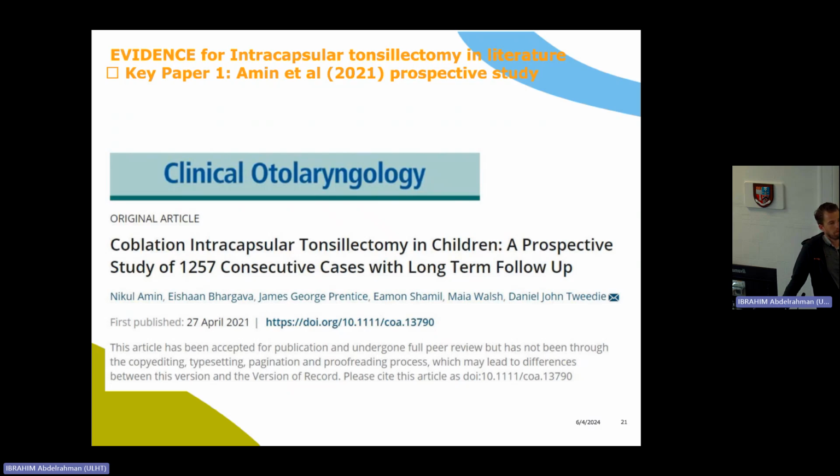But millions of these have been done now, and there's nothing that's ever come back. It doesn't create any other material or reaction that I'm aware of that can cause harm in any way. Like I said, the only thing that is created is sometimes the gas plasma, the kind of smoke, but that is just the water vapor and oxygen, hydrogen reforming and causing a bit of smoke. There's no real known concerns about that.